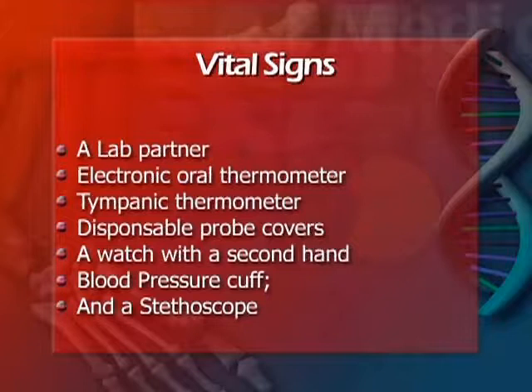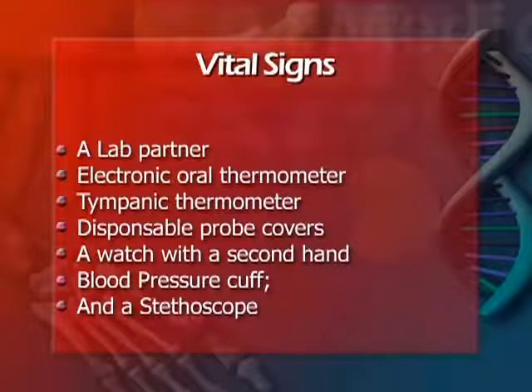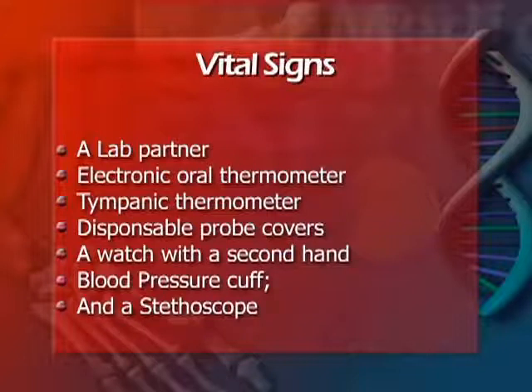To complete this exercise you will need a lab partner, an electronic oral thermometer, a tympanic thermometer, disposable probe covers, a watch with a second hand, a blood pressure cuff, and a stethoscope.